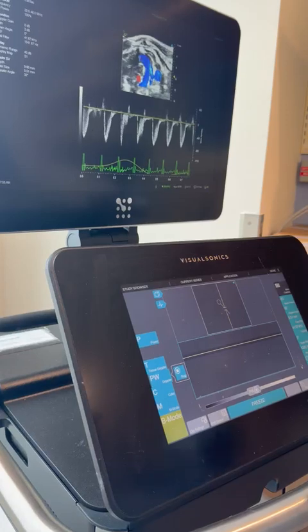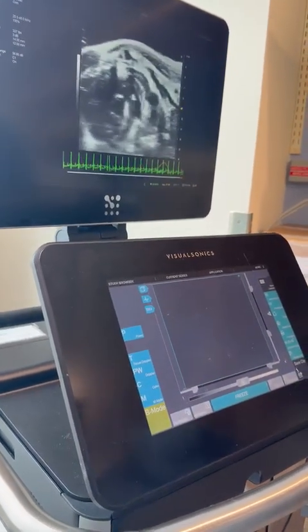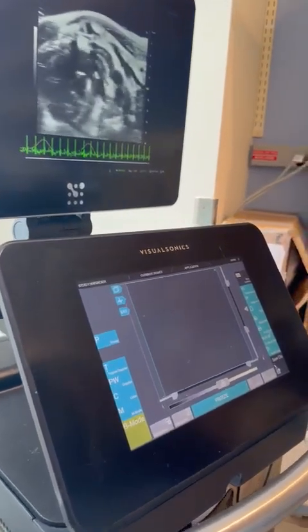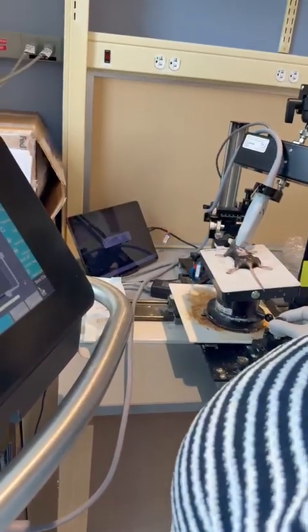You go back to view mode. You want to try 3D? Let's do 4D. Okay. Let's turn your Y knob and push the animal away from us. We're going to try counterclockwise. Okay. Yep.